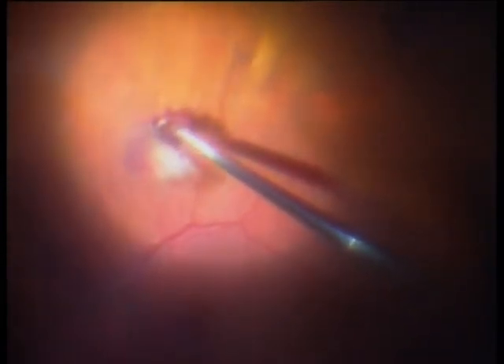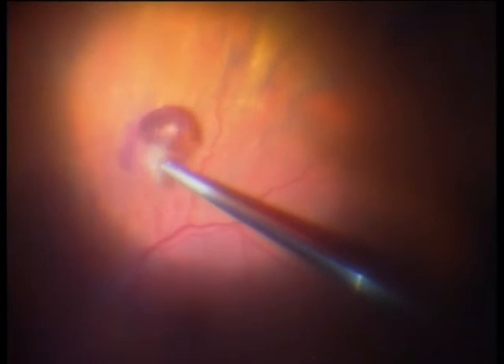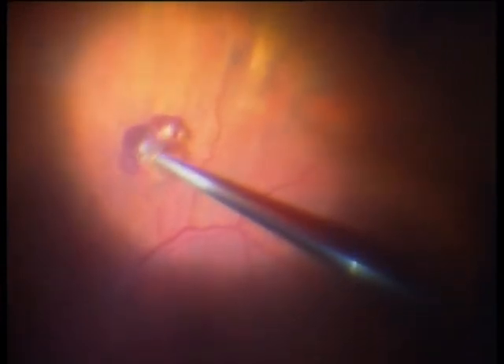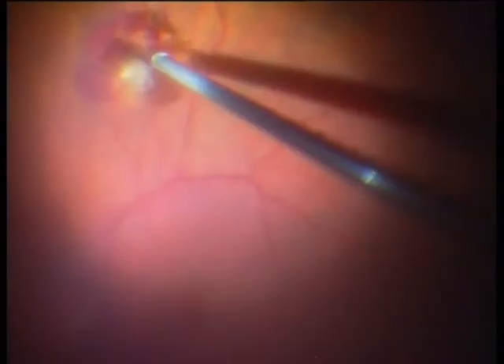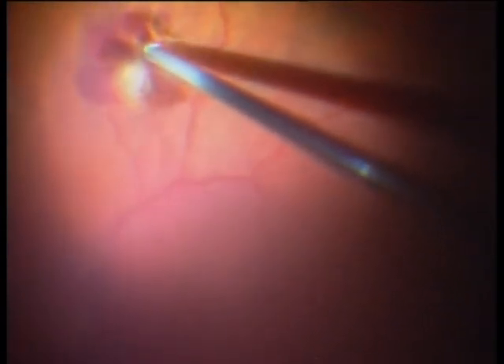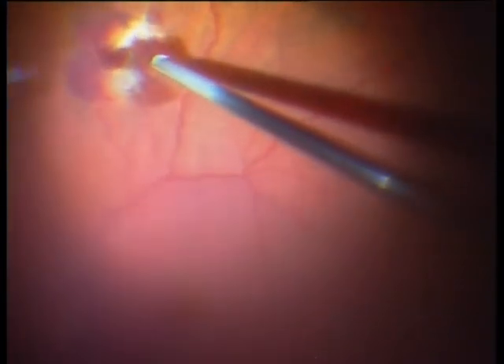There is no further damage to the eye. Luckily it is outside the temporal arcades. You see also that the wound edges have healed very well — that is why it is very important to wait 4 weeks before vitrectomy, so that the wound edges can heal and you have no PVR risk from these wound edges.